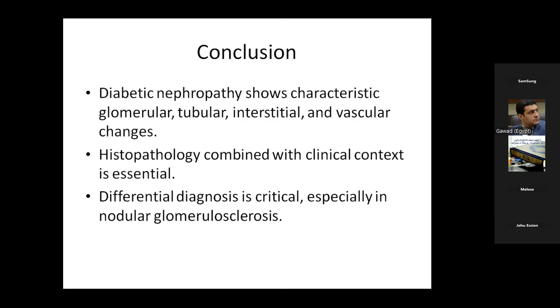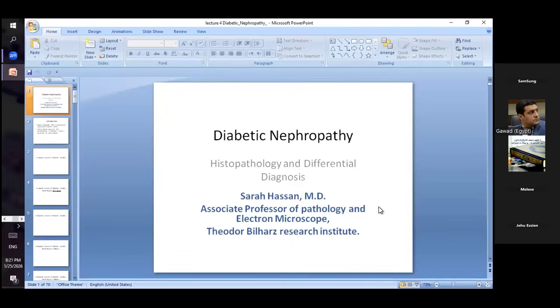Histopathology combined with the clinical context is essential, and differential diagnosis is critical, especially in nodular glomerulosclerosis. And thank you.